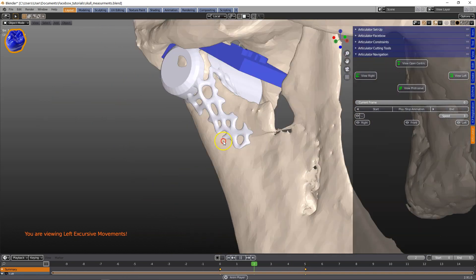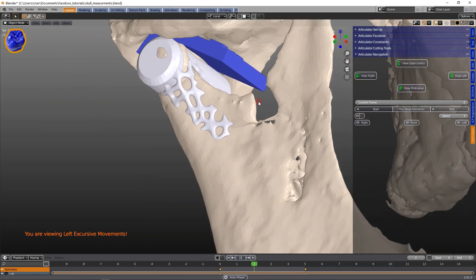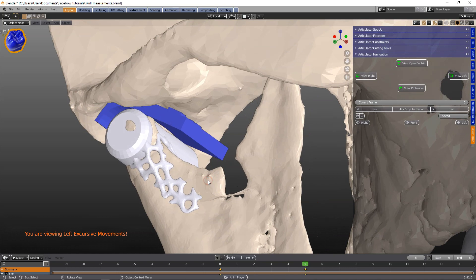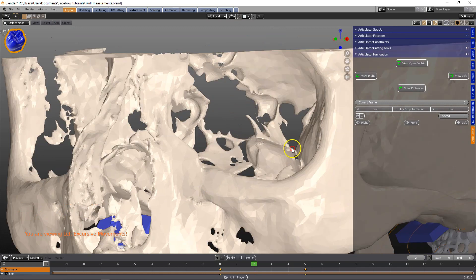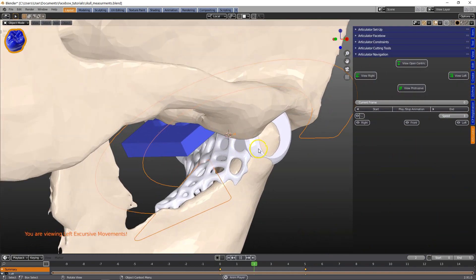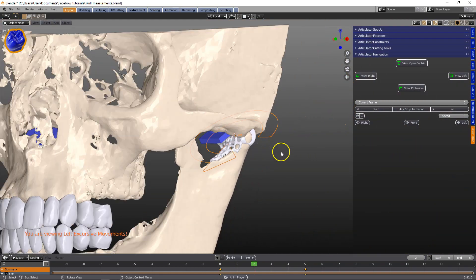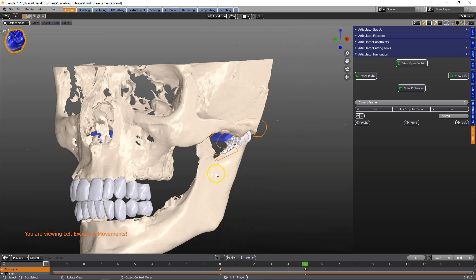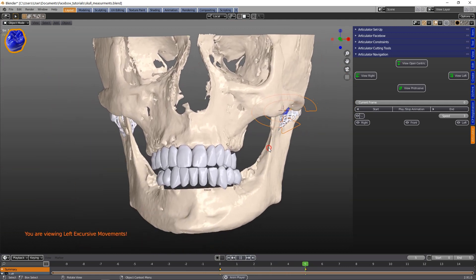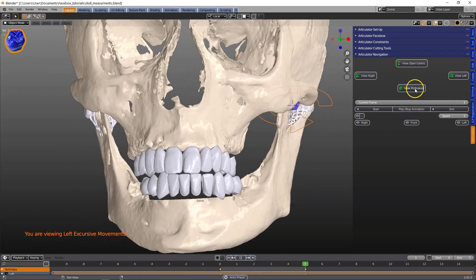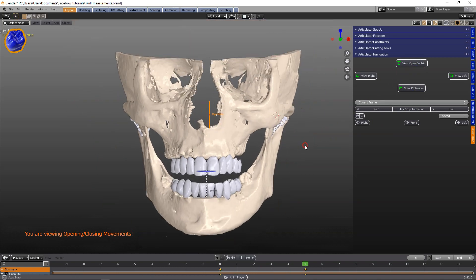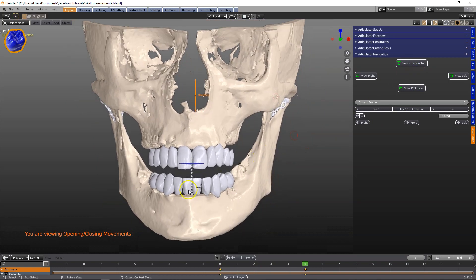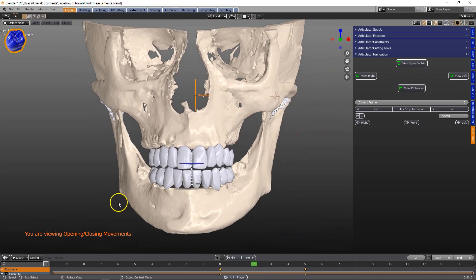On the other side we can see how it moves down, and again the Bennett side shift as it's moving down the condyle on the other side. And that's all folks — hope you enjoyed the video. Goodbye.